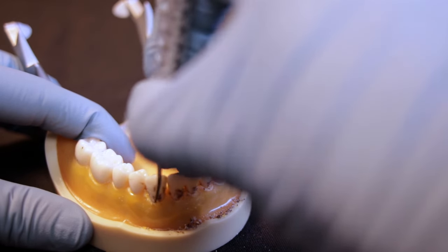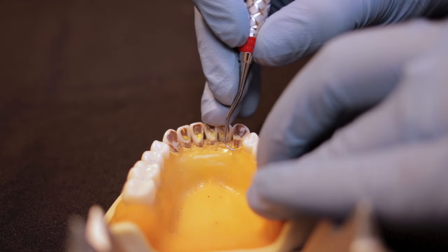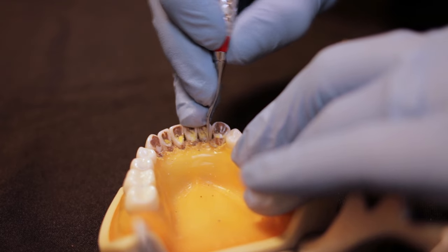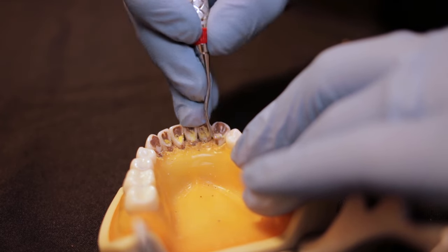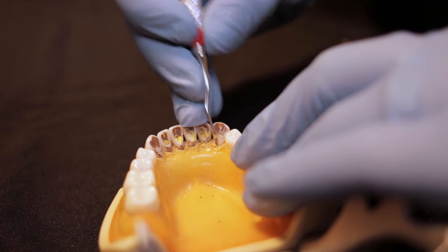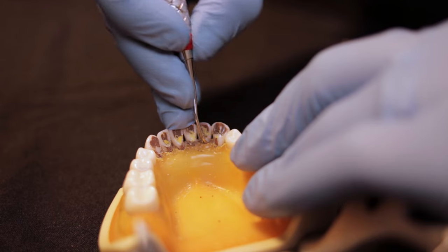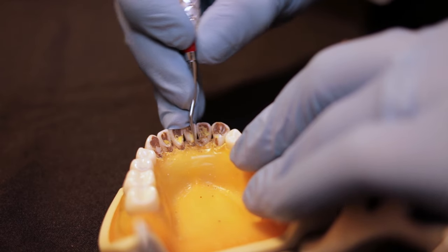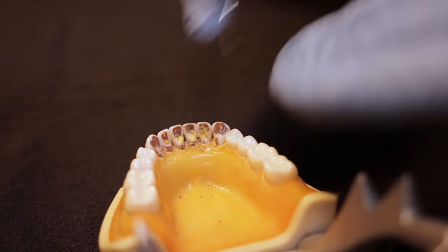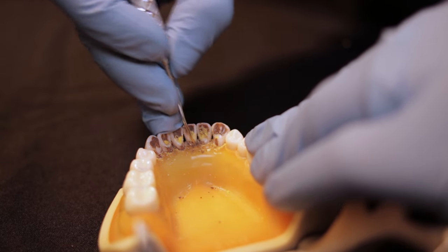Nice overlapping strokes as we finish up, then we're going to go to the lingual side and do the surfaces towards us as well. Stay in your chair position: do surfaces towards on both facial and lingual before switching to surfaces away with the same instrument on facial and lingual. That's how you really save time — by staying in the chair position as long as you can.